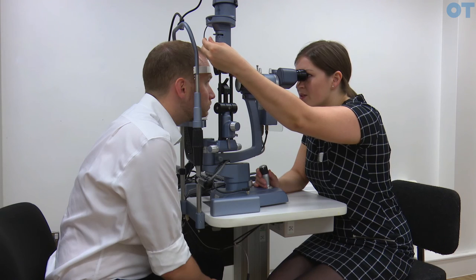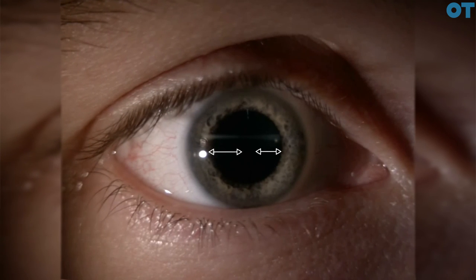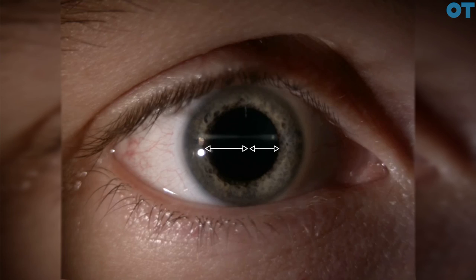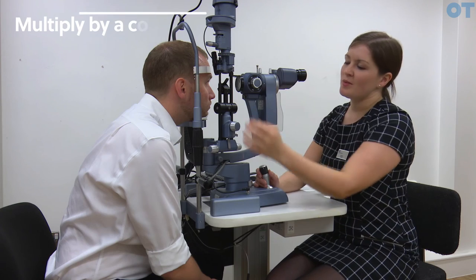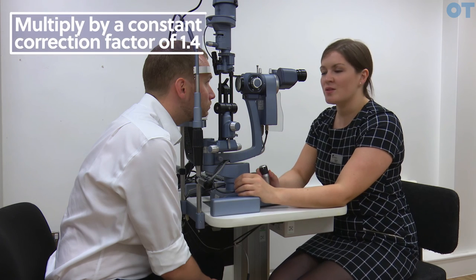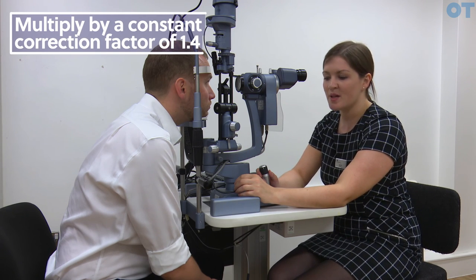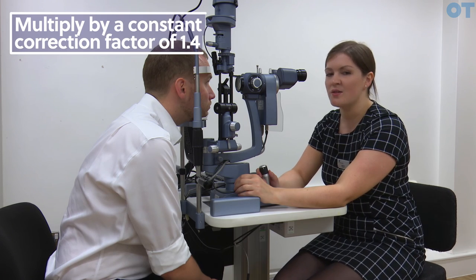What you are doing is using the slit height — gradually increasing the slit height until the two beams just appear to touch. At that point you take a reading from the graticule and multiply the reading by a constant correction factor of 1.4, and that will give you a quantitative measure of the anterior chamber depth.